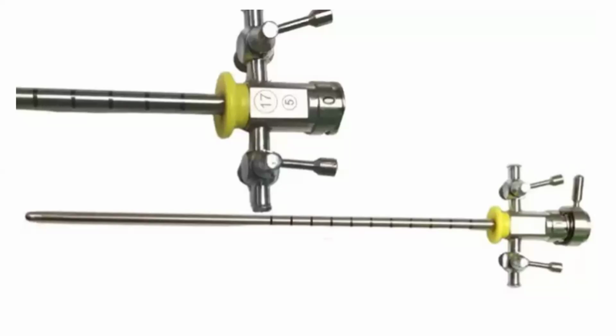You have not given the description of the instrument. Number 2, you are saying there is an inlet and outlet. Which one is inlet and which one is outlet? I mean, it can be used interchangeably, sir. There is no outlet, there is only inlet.